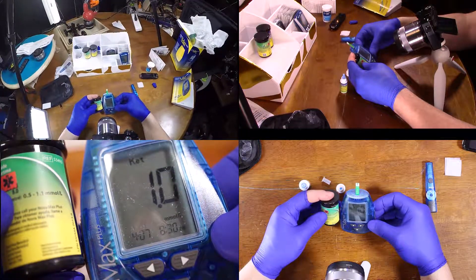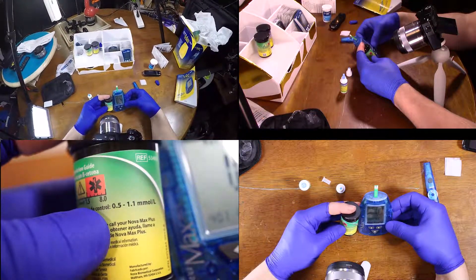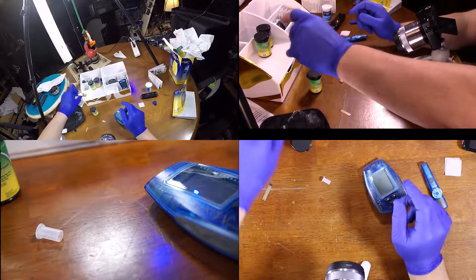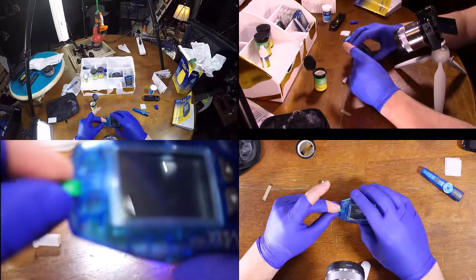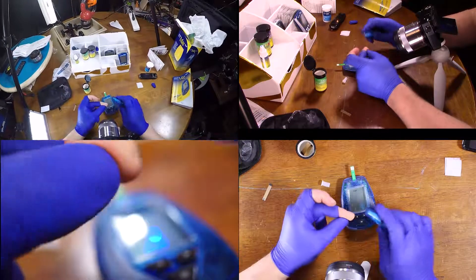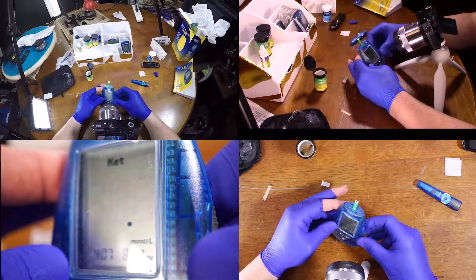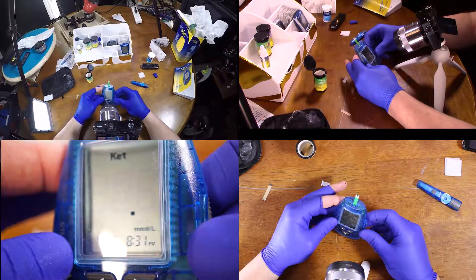Good, that's one, and that's supposed to be... Now this is the moment of truth, because I haven't checked my ketosis levels, and then we'll see where I can go from here.